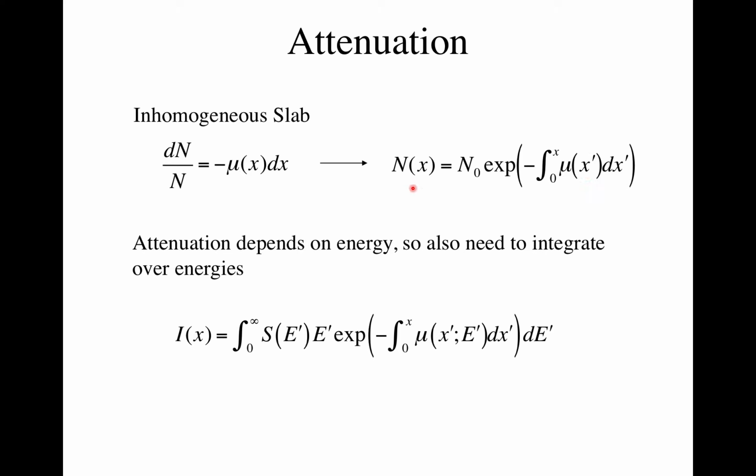This equation is absolutely essential for understanding how CT works. In plain film chest X-rays, you get one projection, and for each ray you get a detected intensity, which is the brightness of your picture, like that hand we put up. In CT, you would like to know the linear attenuation coefficient values all along your ray. You want a three-dimensional picture. So that's what we're going to solve for in CT: now that we know the number that got through on that ray, we also know that it was the sum across all these linear attenuation coefficients.